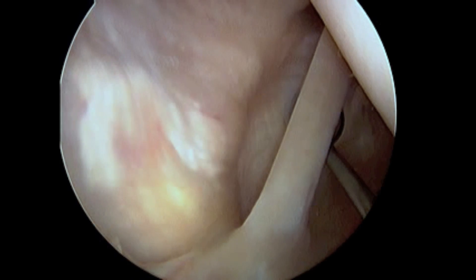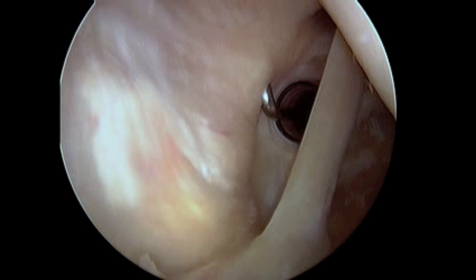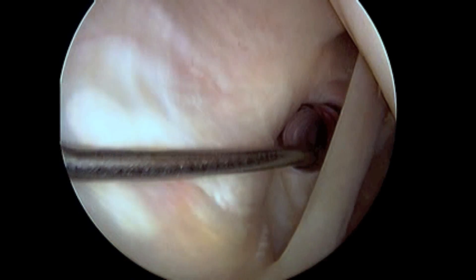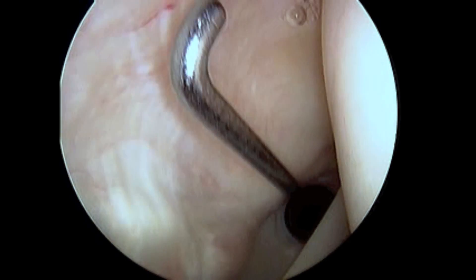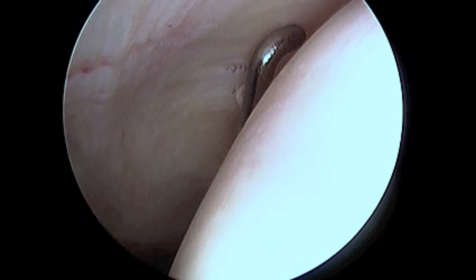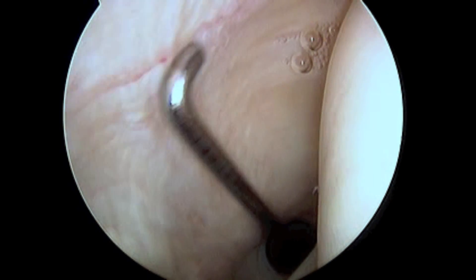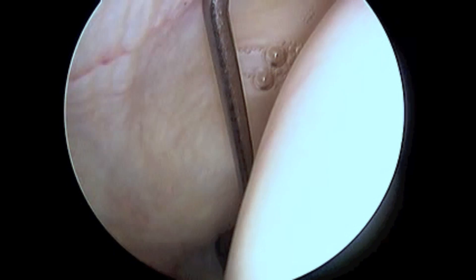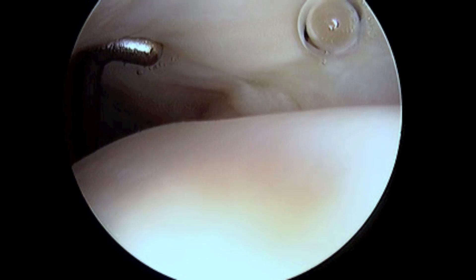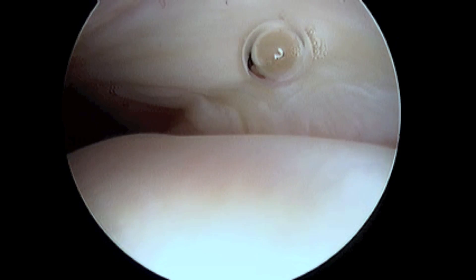Here we can visualize the articular surface of the supraspinatus and infraspinatus rotator cuff tendons. Driving the arthroscope superiorly and laterally, one can evaluate the broad insertion of the supraspinatus and infraspinatus on the greater tuberosity of the humeral head. There is no evidence for rotator cuff tear.